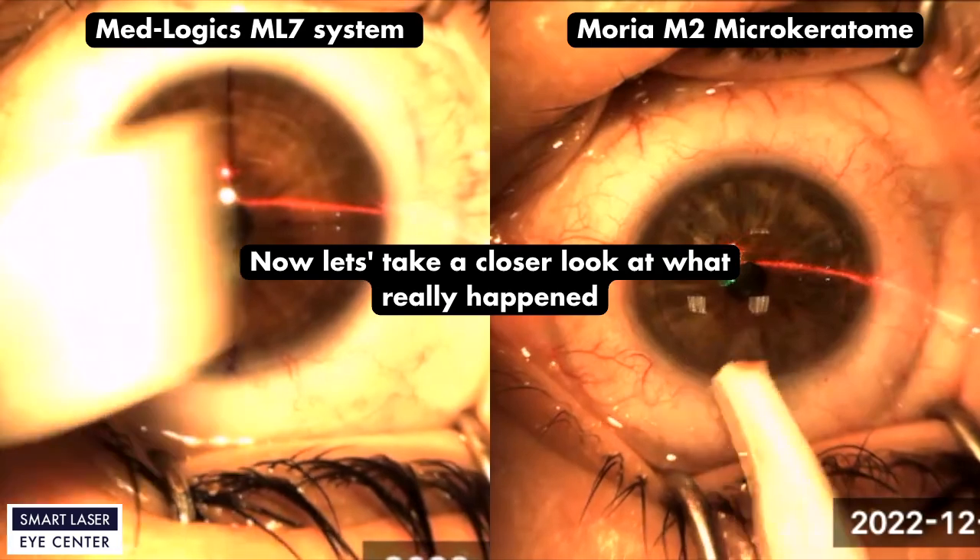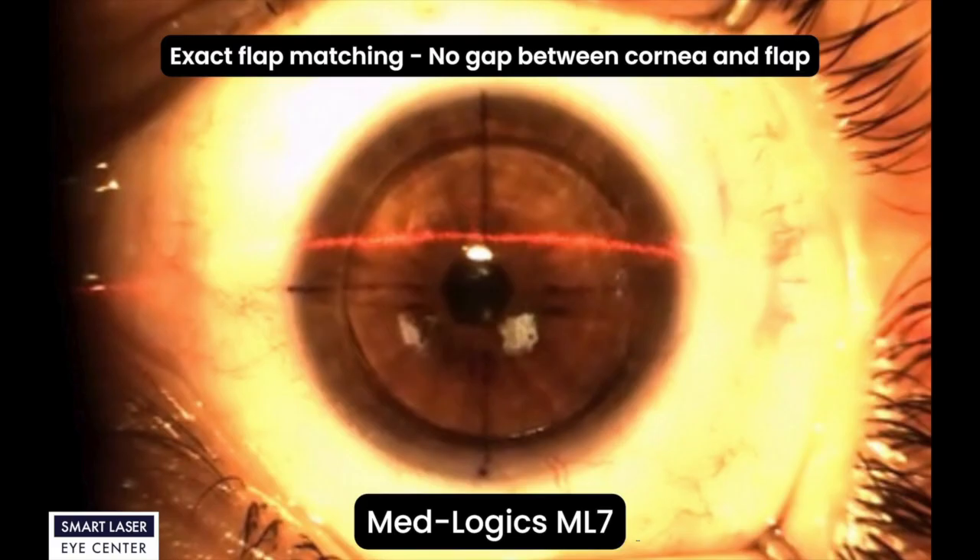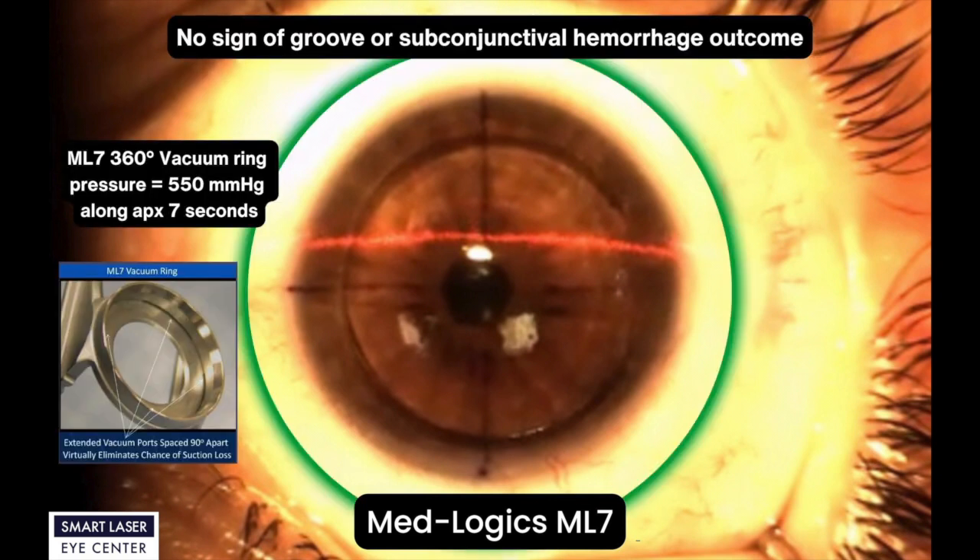Now let's take a closer look at what really happened. If you look at the ML7 final video capture, you can easily see exact flap matching. The final shape of the cornea is very symmetrical and spherical. There is no significant gap between cornea and flap. Now let's take a closer look at the biomechanical principles of the ML7 that allow this successful surgery.